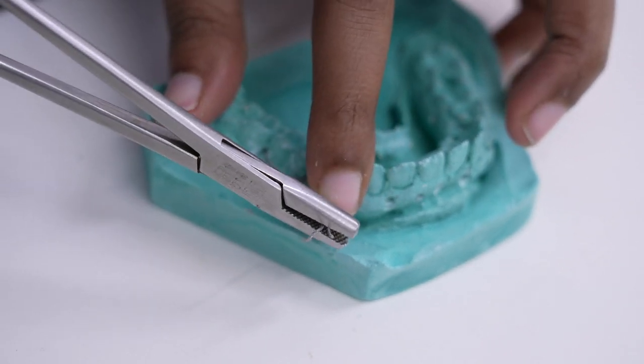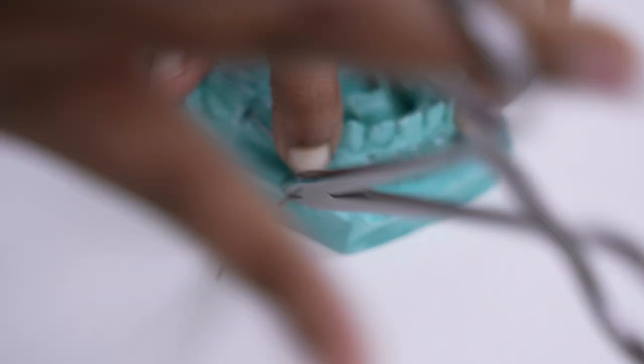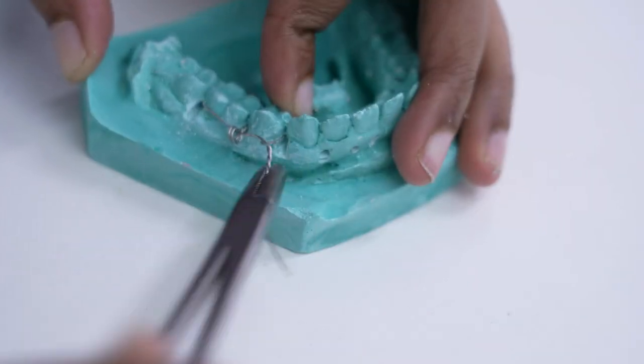Distal to mesial is always the direction. Secure both the wires and pull the wires towards you, because in the patient's mouth you do not want any kind of injury.